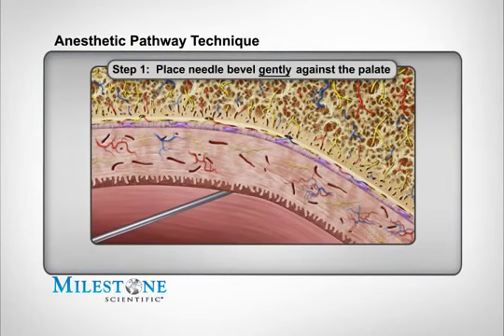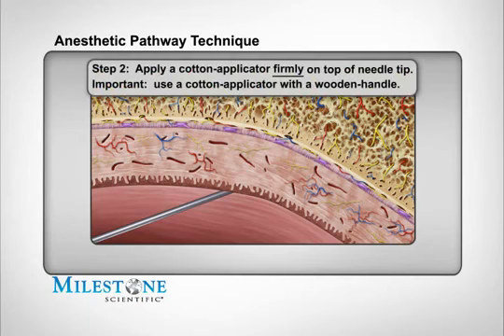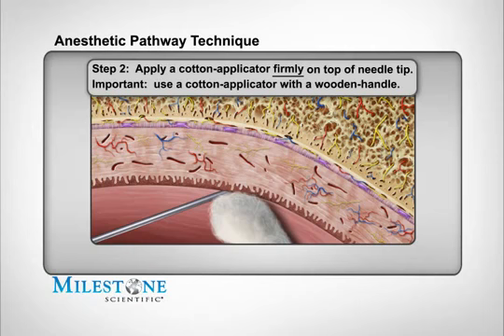Step 1: Start by gently placing the bevel of the needle against the surface of the palate. This is achieved by holding the handpiece at approximately a 45-degree angle to the palatal surface. Step 2: Stabilize the needle by applying firm positive pressure from a cotton applicator. It's best to use a wooden handle cotton applicator so that adequate positive pressure can be applied. The applicator also absorbs any excess anesthetic solution and makes for a more comfortable needle entry.